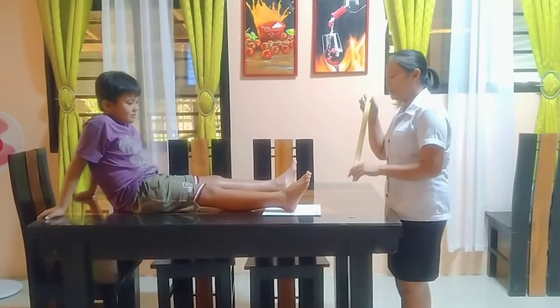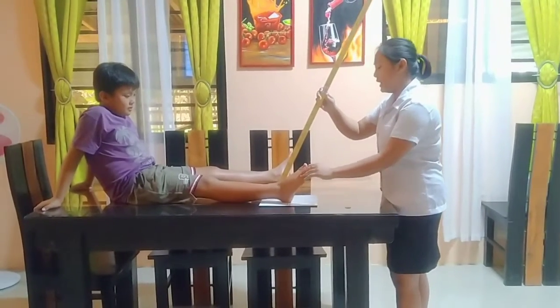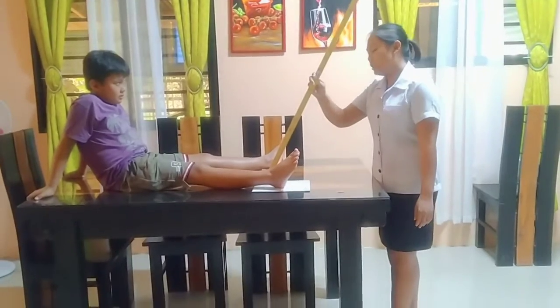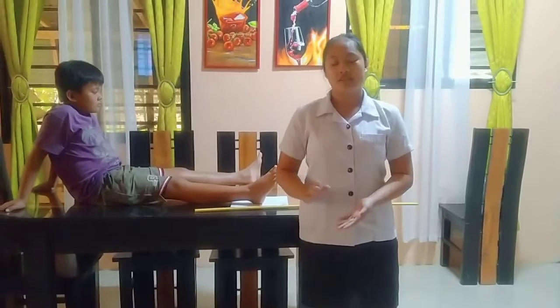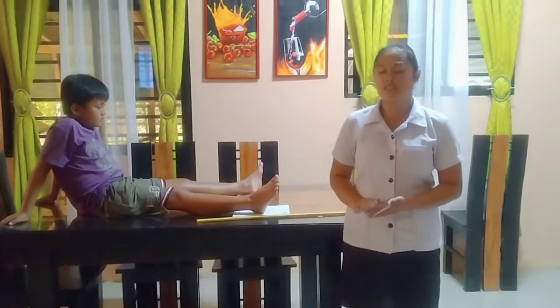So the central ray will have angulation of 10 degrees through the 1 inch posterior to the malleolus. So this shows the posterior articulation facet and posterior subtalar joint.